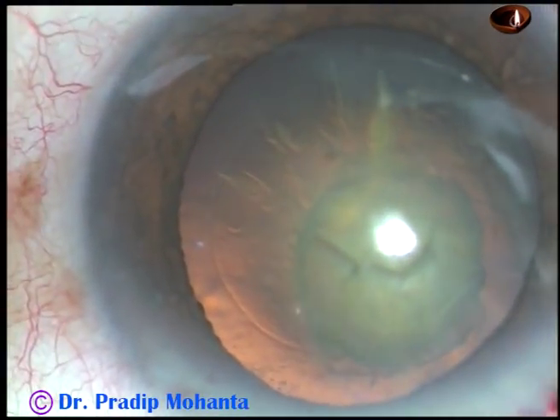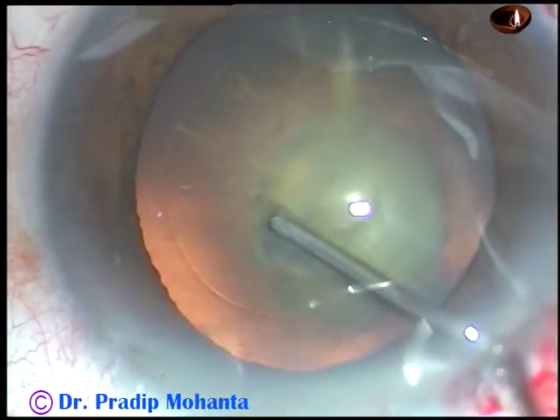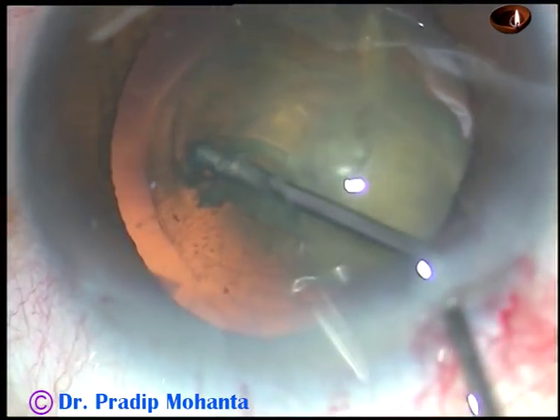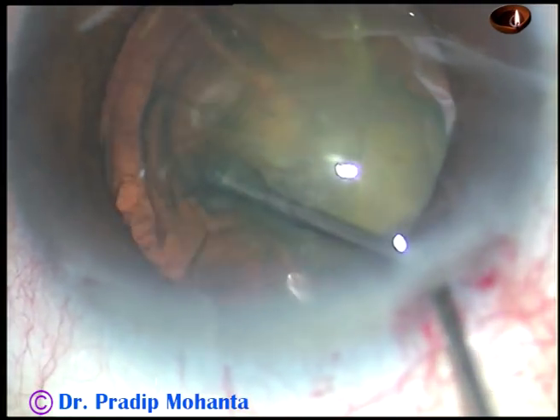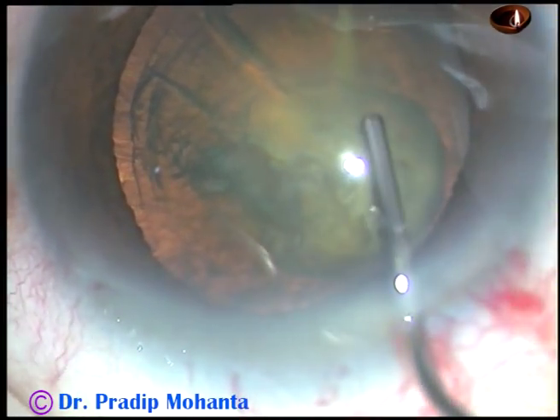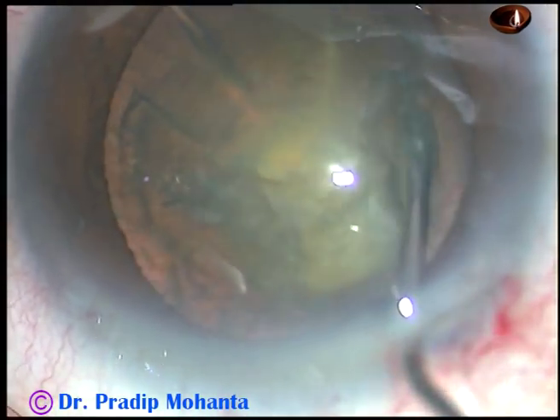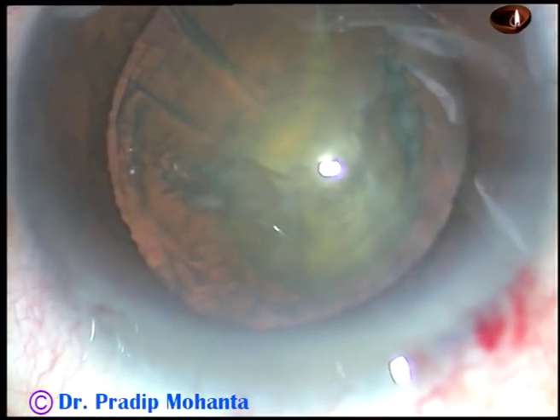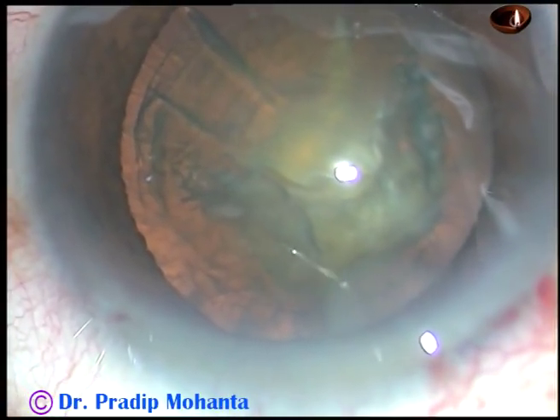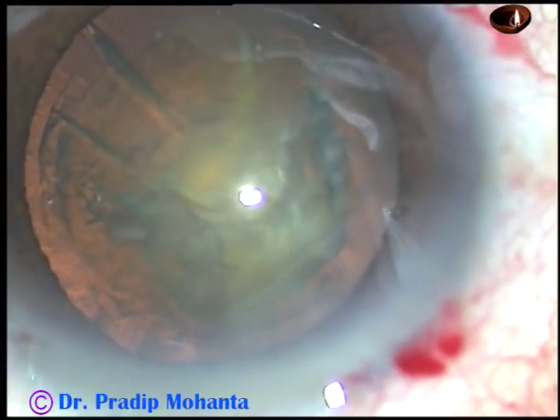I don't want to do hydrodissection in this case. I want to do hydrodelineation. So I go into the substance of the lens matter in the periphery and inject some fluid. I go to the other side away from the equator in the substance of the nucleus and then inject some balanced salt solution. And now, partial hydrodelineation has occurred.